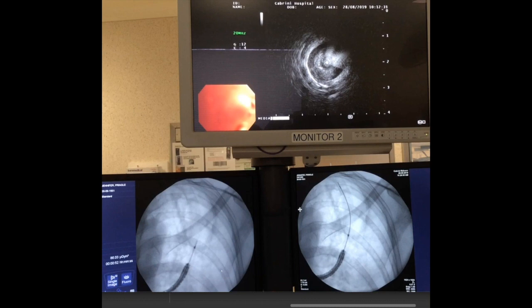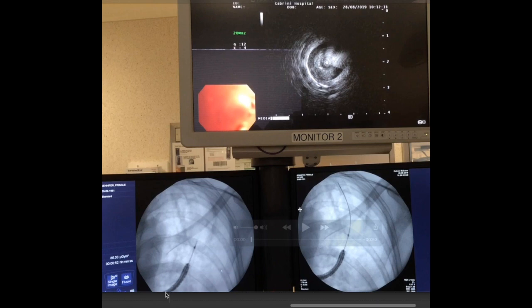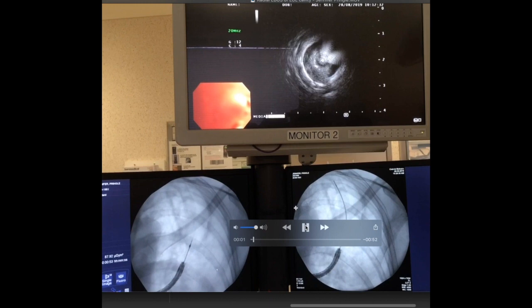Here's the bronchoscopic procedure. On this screen we have the radial EBUS image, and on this one we have the fluoroscopy image. Here you can see the bronchoscope sitting in the apico-posterior segment of the left upper lobe, and beyond that is the radial EBUS ultrasound within the guide sheath. This is the tip of the guide sheath, and beyond there you can see the ultrasound protrudes out. On the fluoroscopy you can see the outline of the cavity, which is what we saw on the CT scan. Watch what happens to the ultrasound image as it's pushed out into the lung.